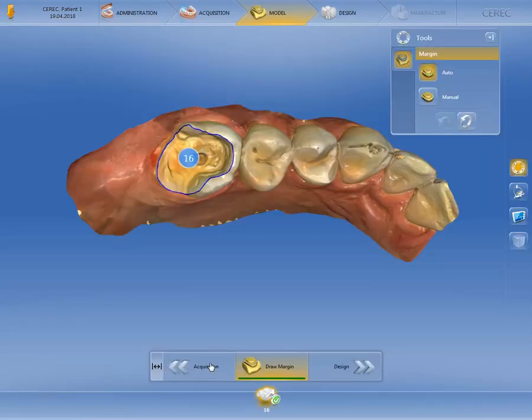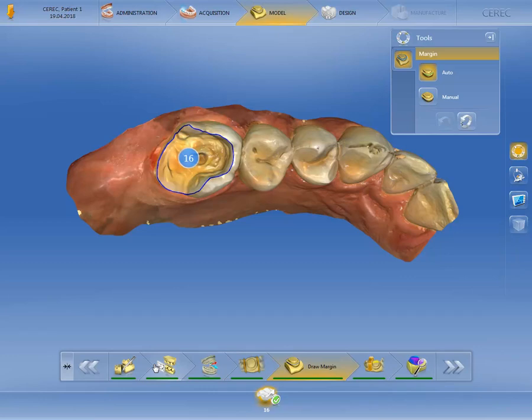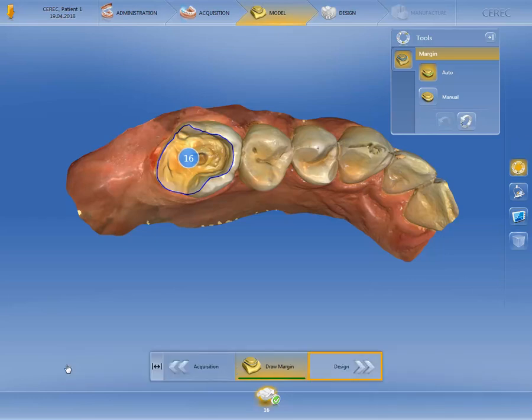Now we have reached the model phase and the initial proposal for the determined preparation margin appears automatically. You can correct it by using the tools or remove and redefine it if necessary. For illustration purposes, we will expand our step menu to the full view. All steps are already marked with a green bar and are therefore automatically determined by the CEREC software 4.6. At any time, you have the option to switch to the various steps and make changes. In our case, we will minimize the step menu again and switch to the design phase without making any changes in the model phase.